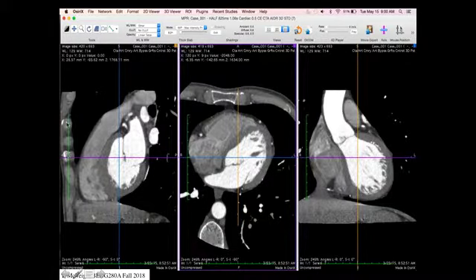And so their patient's chest is now over here, their diaphragm is here, and it's like we're looking from their left arm through sideways, right? You can orient these planes however you wish, so you can tilt them to match the physiology you'd like to image or investigate. You can draw curved planes and paint the image pixels from that curved plane onto that, and so now you have a curved plane that you have an image on.